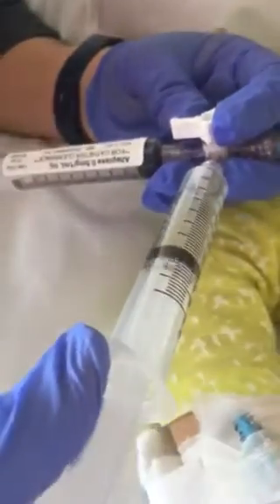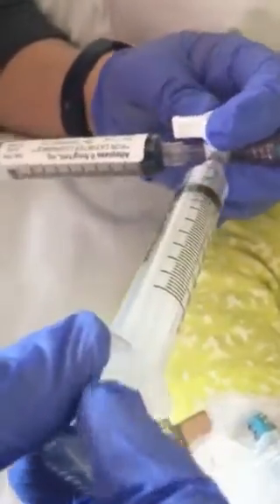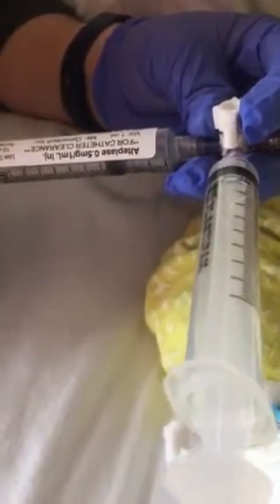Once all the TPA gets into the empty syringe, we basically do the same repetition but we swap the syringes. We pull back on that syringe, turn it off, and the hope is that a little bit of the TPA in here will suck in.